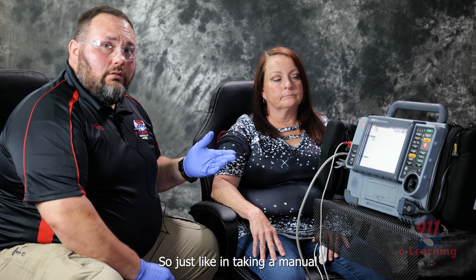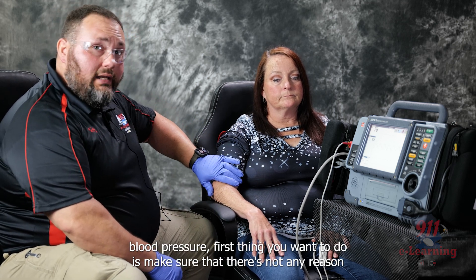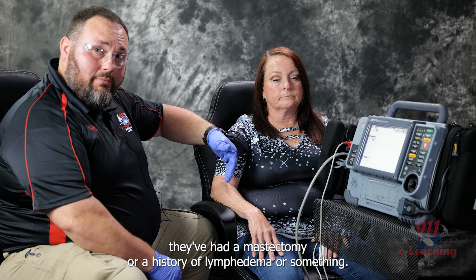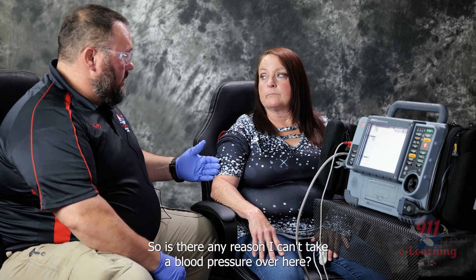Just like taking a manual blood pressure, the first thing you want to do is make sure there's not any reason you can't take a blood pressure on a particular arm — whether they've got a fistula shunt, they've had a mastectomy, or a history of lymphedema or something. So is there any reason I can't take a blood pressure over here?